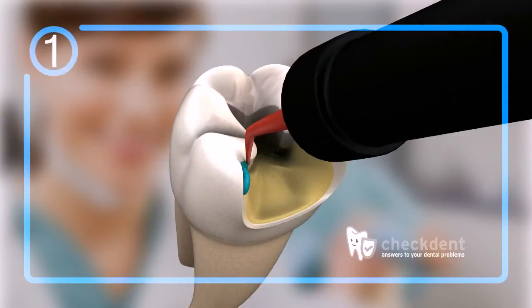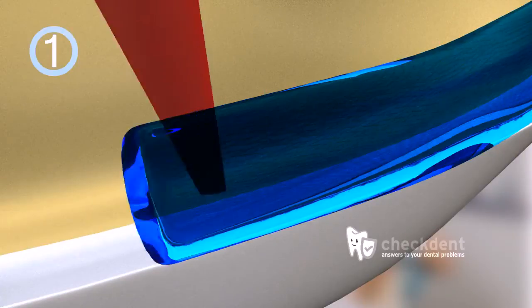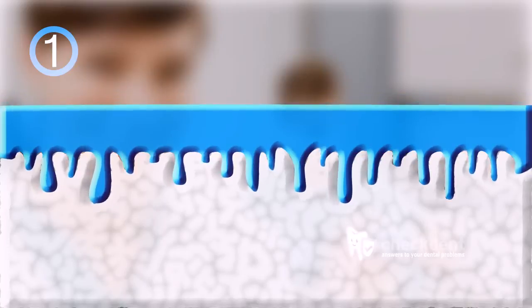Step 1: etching the surfaces of restorations and or teeth. This etching process roughens the surface of the tooth and or the restoration, creating a so-called micro-retentive pattern. The animation shows the cross-section of a tooth while the etching gel is being applied. At first, the surface of the tooth is smooth. As time passes, the etching gel eats its way into the dental enamel and creates small lacunae and pores.